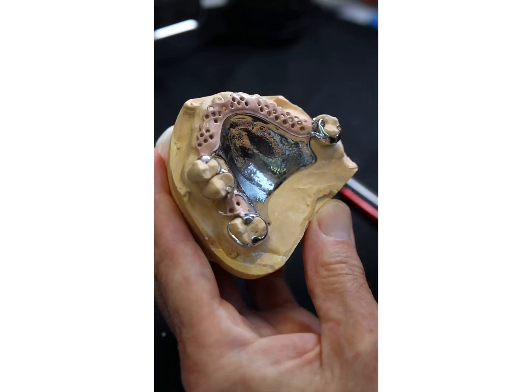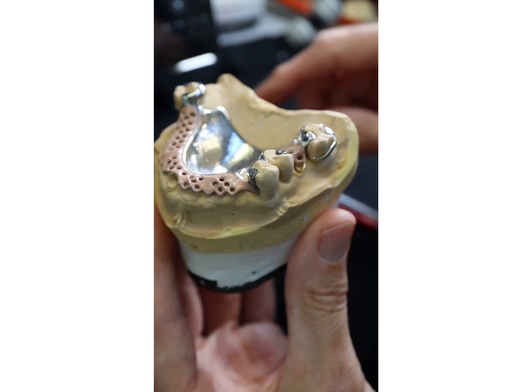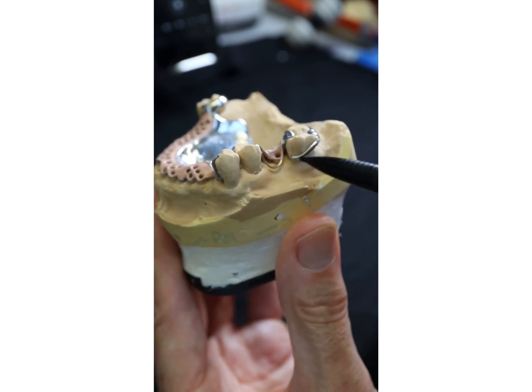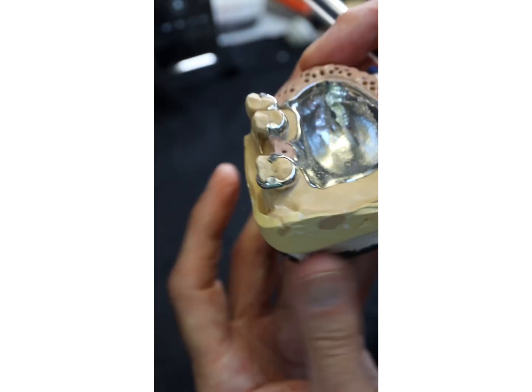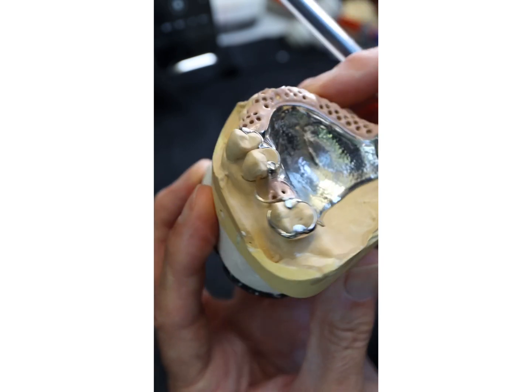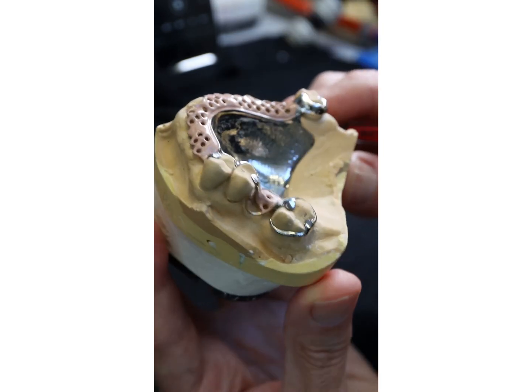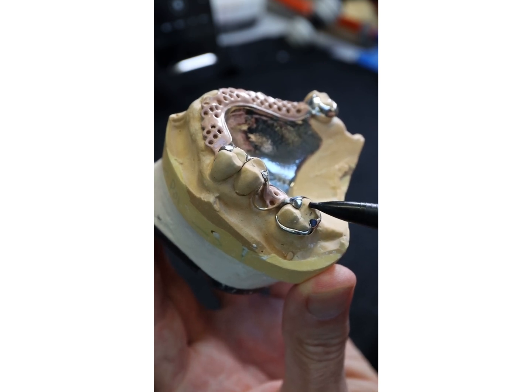We're now going to talk about the clasps as a separate short video. So retention is coming from contact surface, contact surface, contact surface over here, and the palatal aspects of the abutment teeth on the right-hand side and the palatal aspect of the molar tooth on this side. Now this was a bridge abutment — I don't know what's underneath it, I don't know how robust it is.